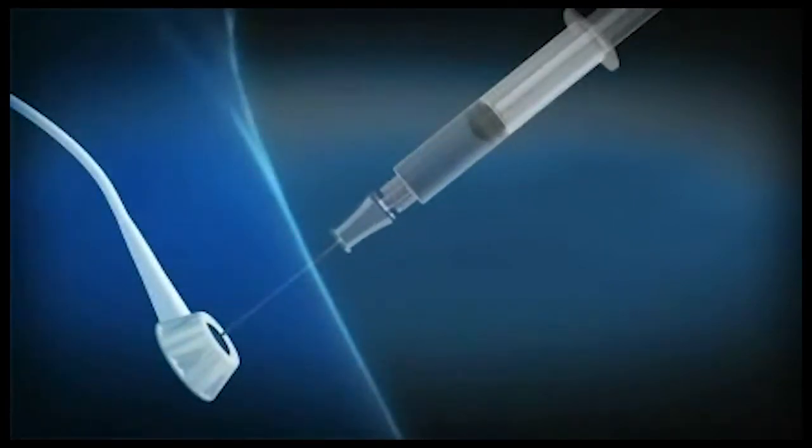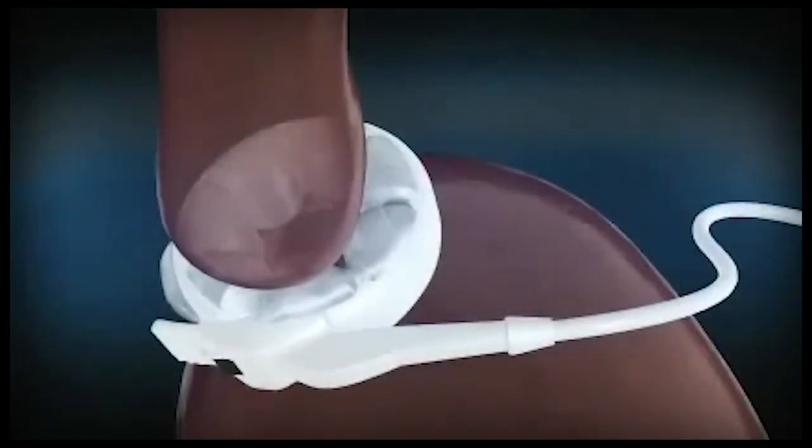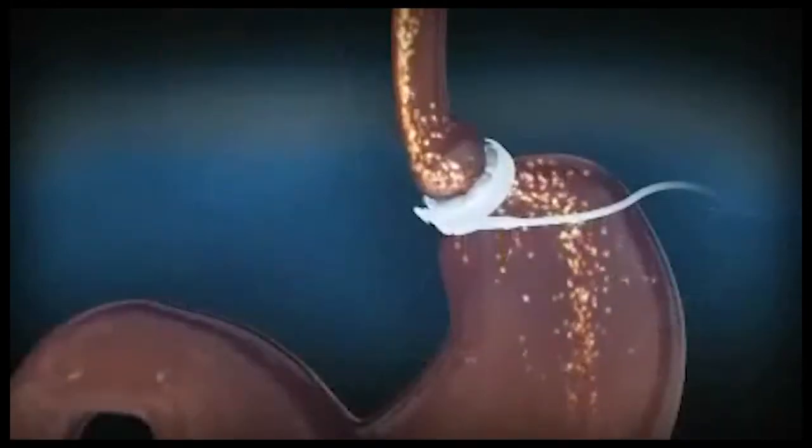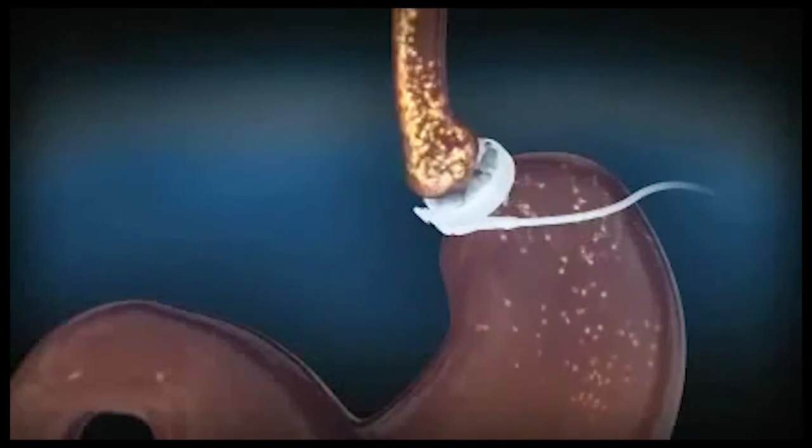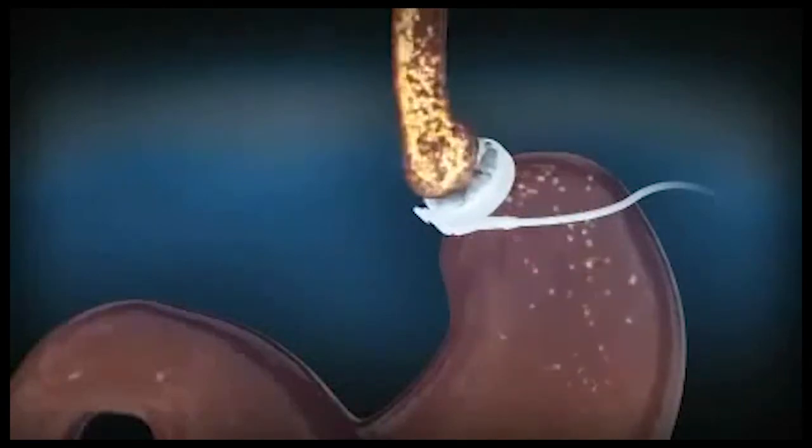As saline inflates the inner surface of the LapBand system, the stomach outlet becomes smaller. This helps reduce the amount of food you eat and slows the emptying of food from the upper to the lower part of the stomach. This helps you feel full sooner and stay full longer.